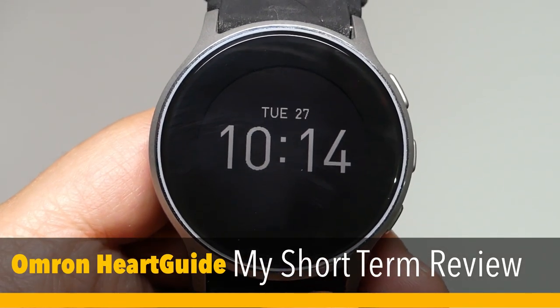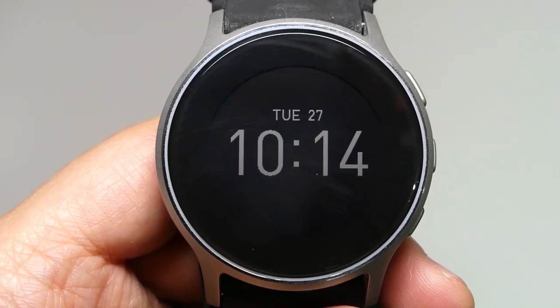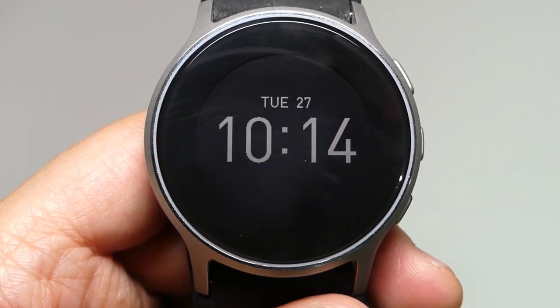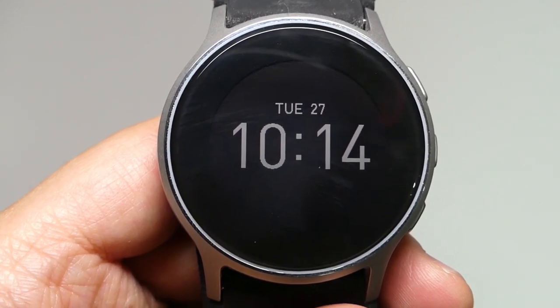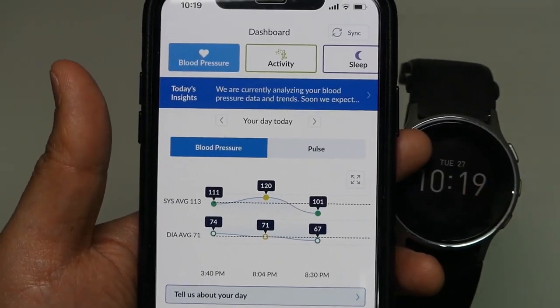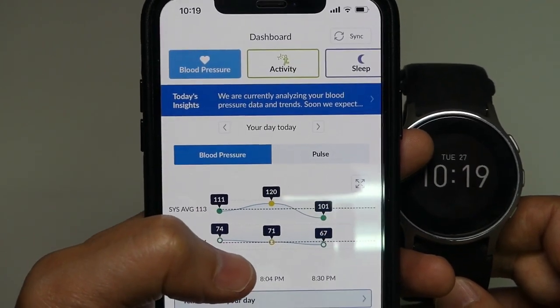Hi, in today's video, I'm gonna do the review of this Omron Hardguide smartwatch. In the last video, I did an unboxing. If you are interested, please check out the link down below. And this smartwatch has some pros and cons. Let me talk about the pros first.